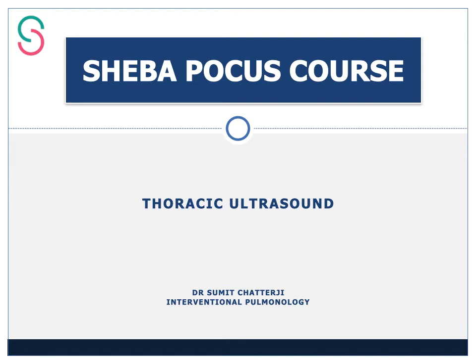So welcome to the thoracic ultrasound module of the Sheba point-of-care ultrasound course. I'd like to show you some of the basic and fundamental aspects of lung ultrasound in the next 50 odd slides.